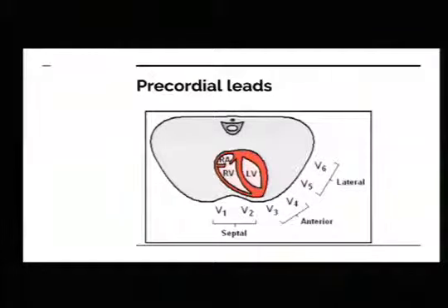One thing I wanted to point out is when you put these on, you have to make sure you're getting down to the chest wall. I've seen them placed by ER techs, medics, nurses, way up high because they don't want to deal with women and breast tissue and moving it, but you have to get it down on the chest wall. Putting it on top of breast tissue can really alter your vectors in your EKG. So just FYI.